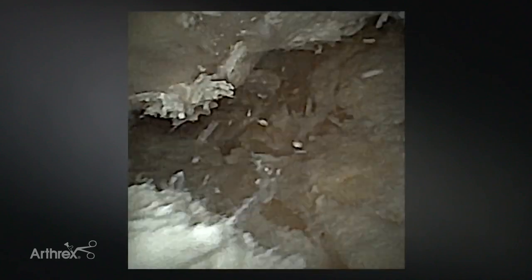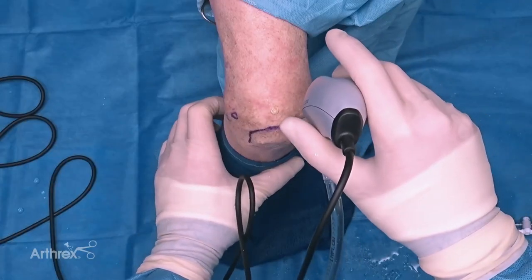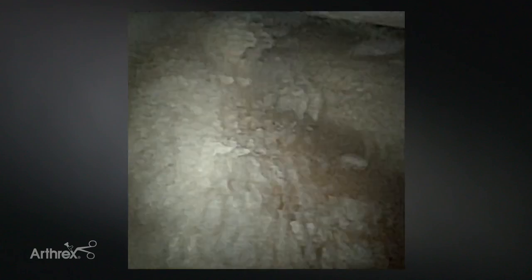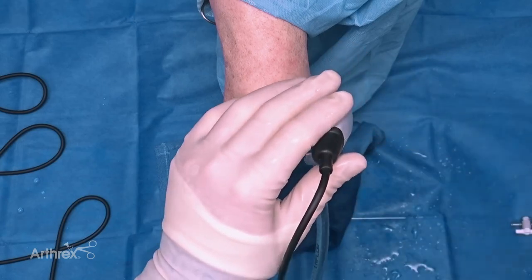This is an obviously arthritic elbow. Slide down - you can see the trochlea in that direction. Here we are in the soft spot, headed towards the radial head, and again I'm viewing with the straight cannula, not the angled one. Here we get a nice view of the radial head. To improve that view, I could use the angled cannula if needed.